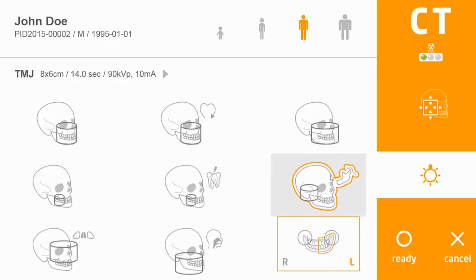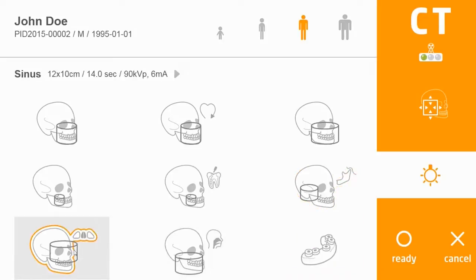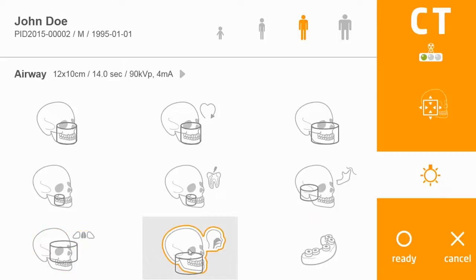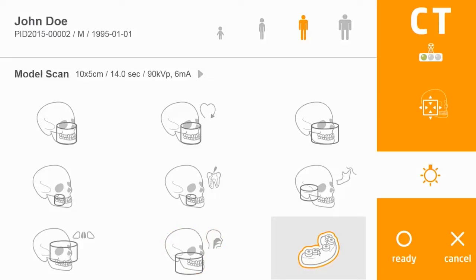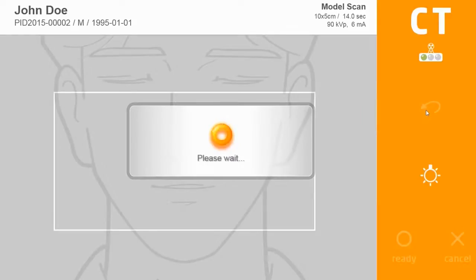To the right is scanning a single unilateral TMJ 3D acquisition. The next option allows scanning for 3D sinus. To the right of that is airway, which enables diagnosis and ENT treatment. Finally, the guide icon option provides 200 micrometers for model scanning. In the orange section you can adjust the field of view with the remote.